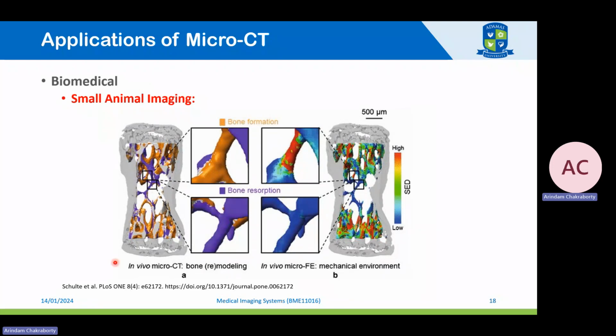This is what is captured in the clinical or laboratory setting, and this is what is predicted using the computational setting or computational simulation. Both the data are identical, they were captured from data. Due to this irregular, detailed trabecular arrangement, it can be seen that the prediction of the computational system is comparatively accurate in predicting the overall performance or the bone formation structure. Again, this has been done over a period of time for that animal without sacrificing the animal, thereby capturing the bone remodeling phenomena.